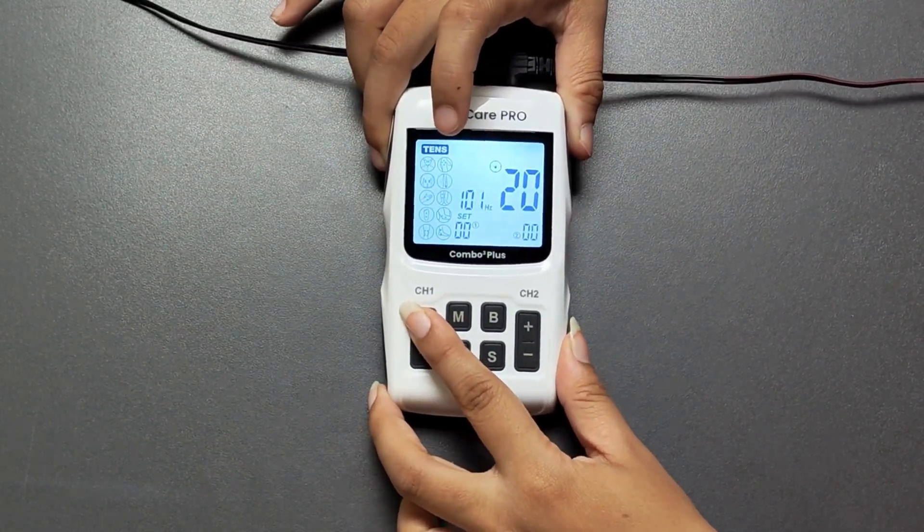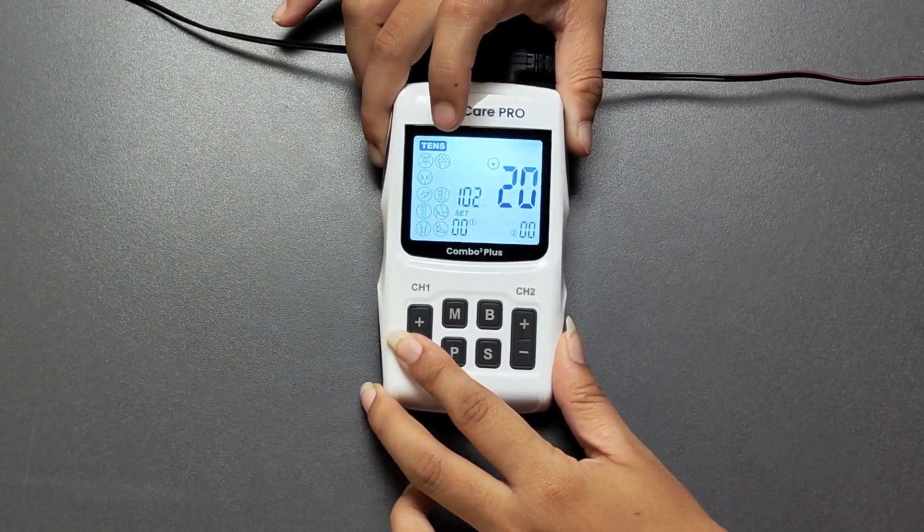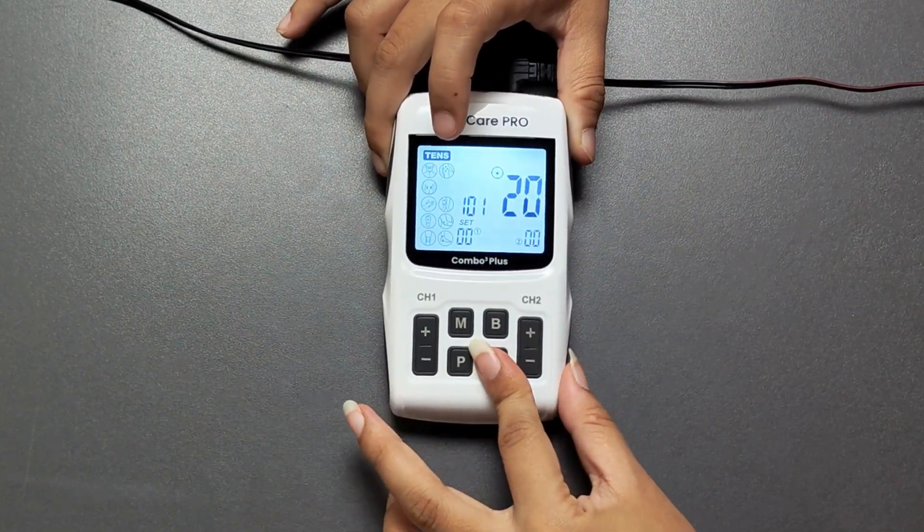Use the plus or minus buttons to adjust each parameter as needed. After adjusting, press S to exit the settings menu.